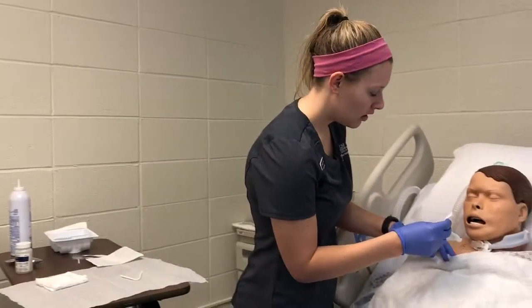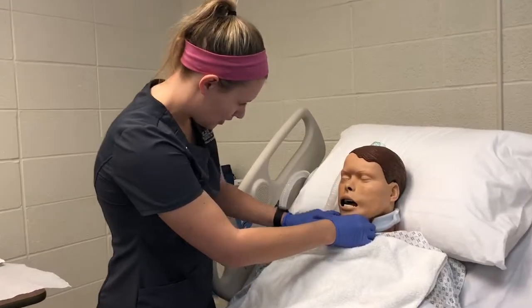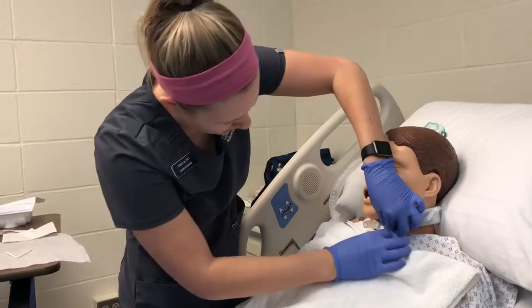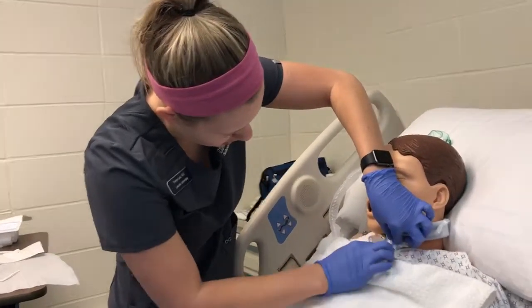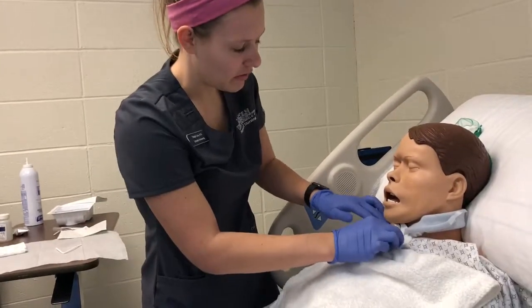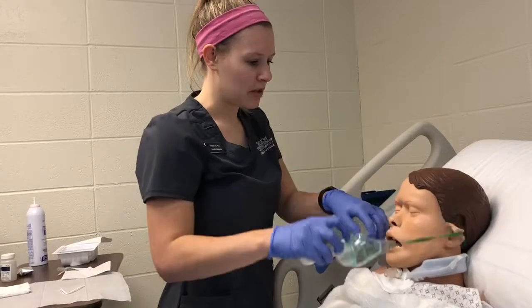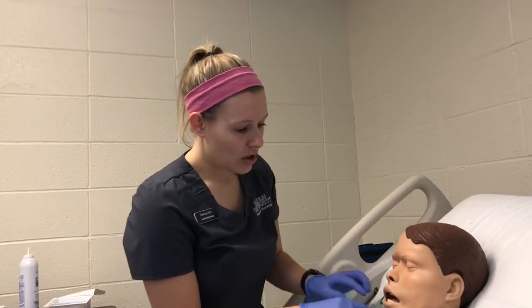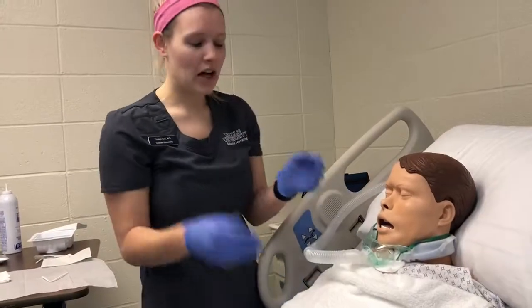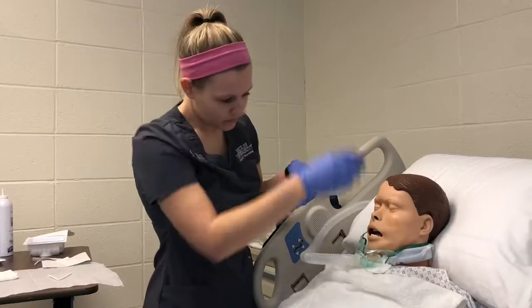I will get it up underneath the trach, making sure that it's dry under there too before I put this on here, because we don't want to have any skin breakdown. That's one of the issues that you can have with trachs, is some significant skin breakdown if you leave any moisture in there. And then we can go ahead and put the oxygen back on while we do the trach ties. So this patient already has a Velcro trach tie on. We don't have any other ones for the simulation, so I'm just going to show you how I would replace it.